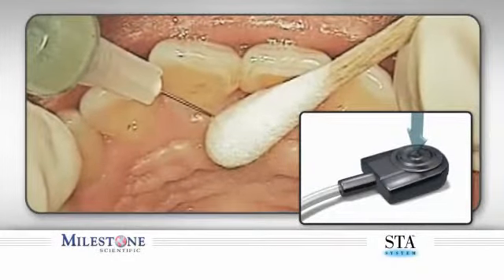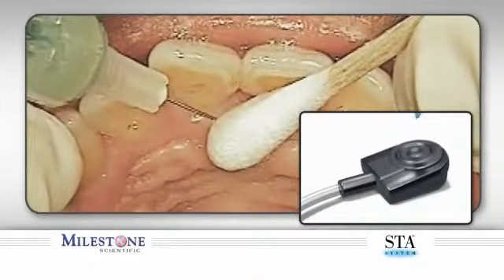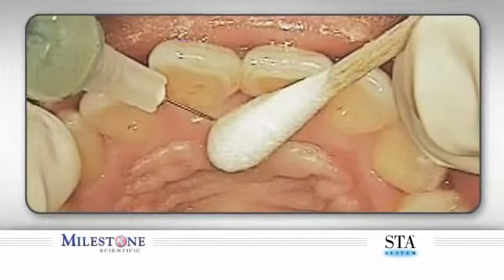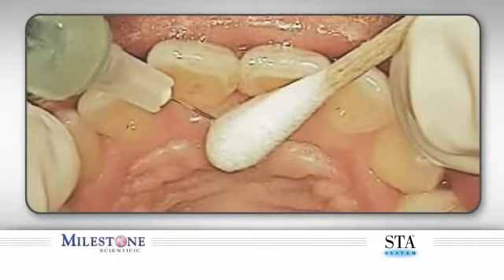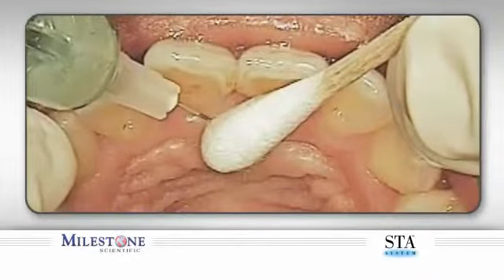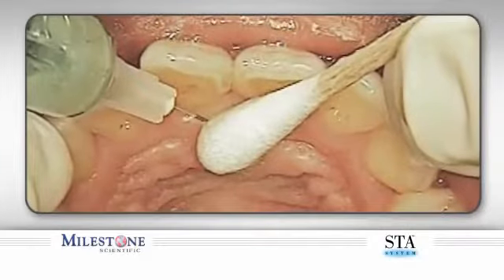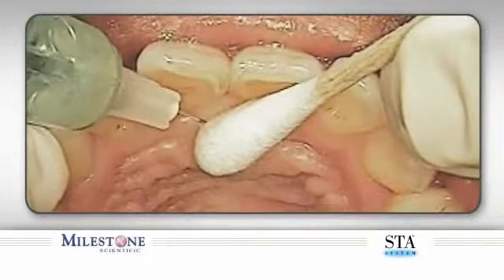Once the needle bevel enters the tissue, pause forward movement for an additional 4 to 5 beeps before advancing again. Next, simultaneously advance the needle 1 to 2 millimeters while rotating back and forth. After the papilla has blanched, reorientate the needle more vertically to gain entrance to the nasopalatine canal and continue to advance the needle very slowly while simultaneously rotating with bidirectional rotation.